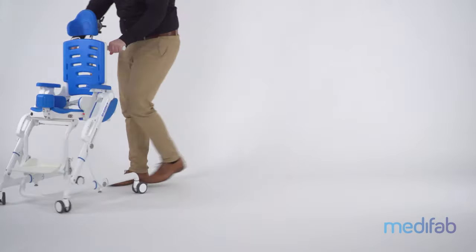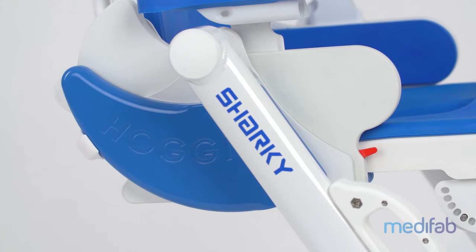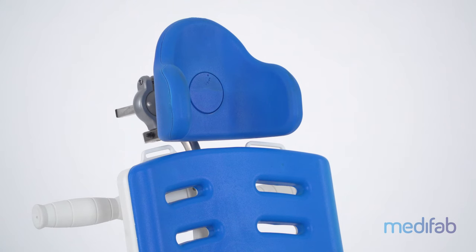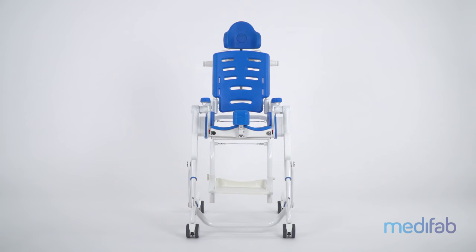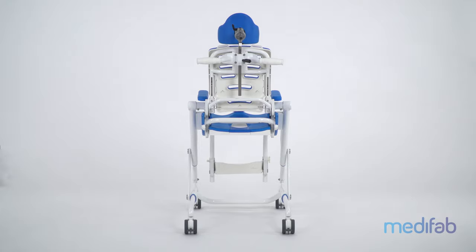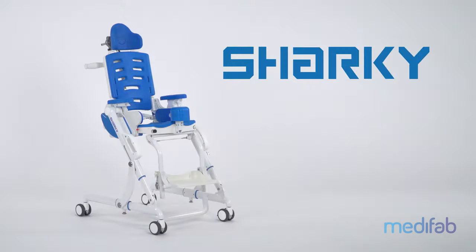Hoggy would like to present their newest product: Sharky, the versatile shower and toilet wheelchair. The Sharky is a sharply designed product with a slim design and is equipped with comfortable polyurethane padding. All metal parts are made of stainless steel and powder-coated aluminium.